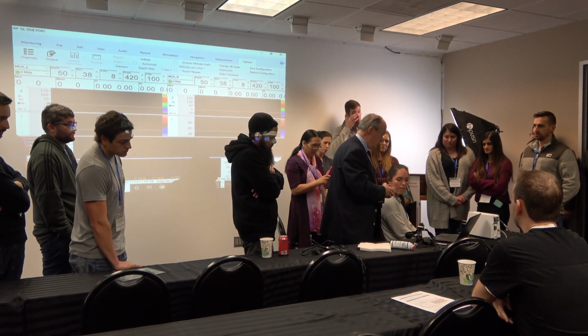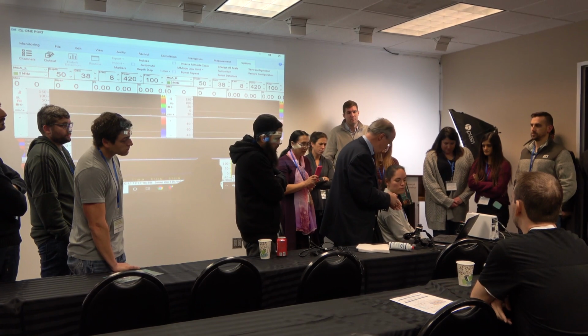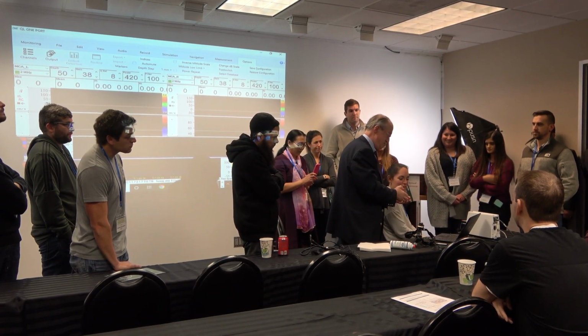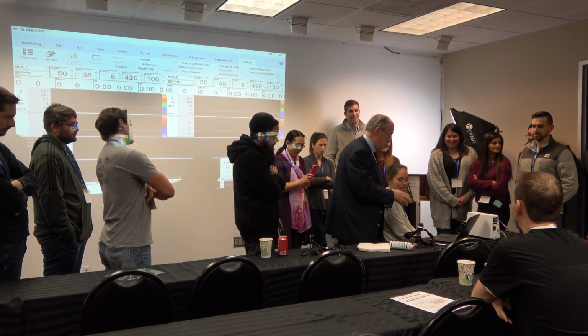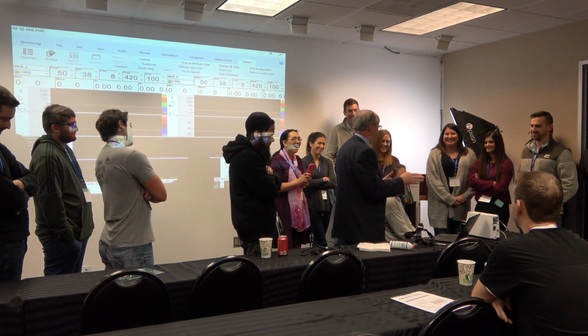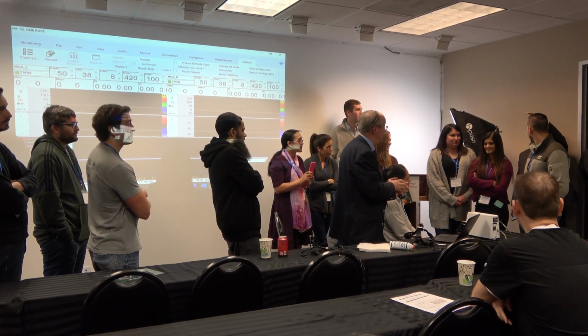Usually, when we are doing patients, it's a very simple explanation. Esther, I will do it now for you. Okay. Monitoring test. All right. Yes. No pain, no needle. We will be listening to brain waves.